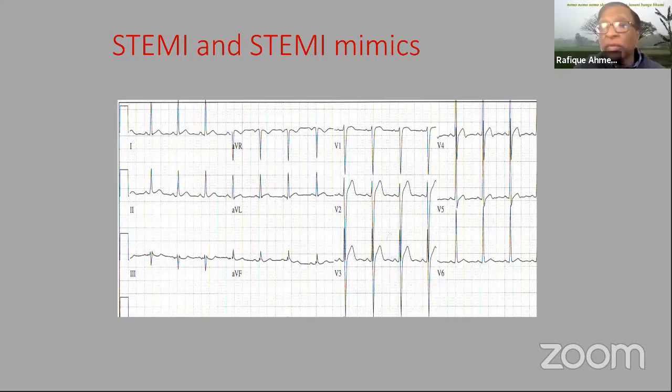So okay, the other question is quite rightly, Rafique Bhai. What I'm trying to tell everyone is that STEMI has two parts, the ST elevation part and the MI part. The ST elevation part is the EKG, but the MI part is the clinical. So we need to combine both to call it STEMI. Otherwise, we'll have to entertain other causes of ST elevation.